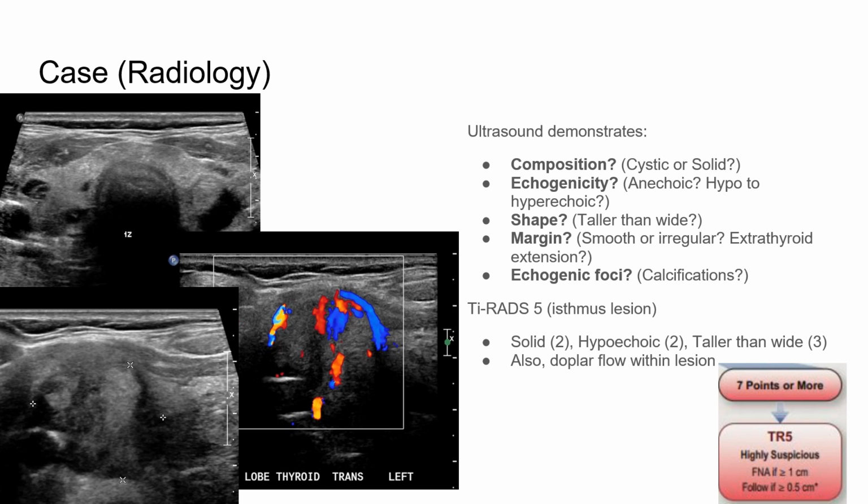So it's looked at by an ultrasound tech or radiologist. We ask the question, and I'll interrupt and say, we're going to focus on this one in the isthmus here. There are also other masses that have some degree of solid and some degree of cystic makeup, but we're focusing on this one in the isthmus, which is a little bit higher level than this one here.